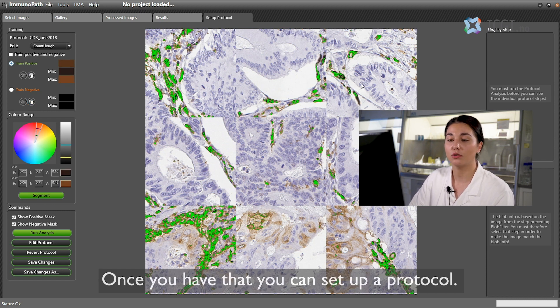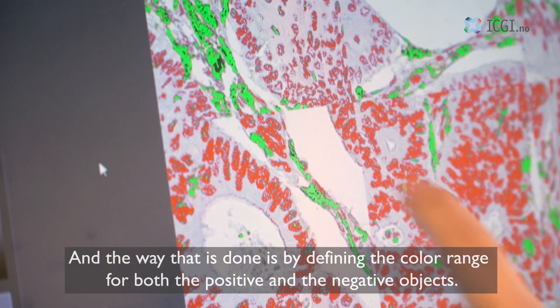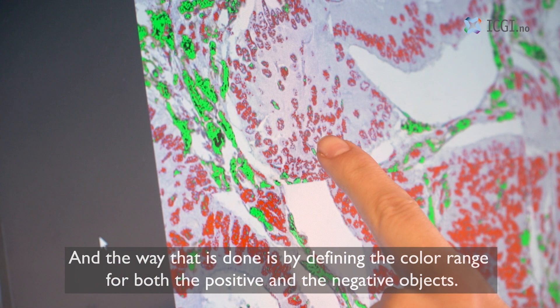Once you have that you can set up a protocol and the way that is done is by defining the color range for both the positive and the negative objects.